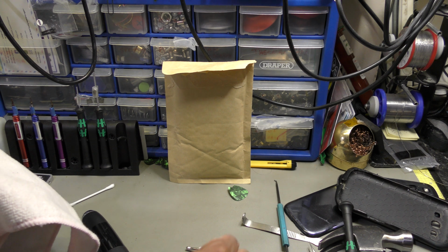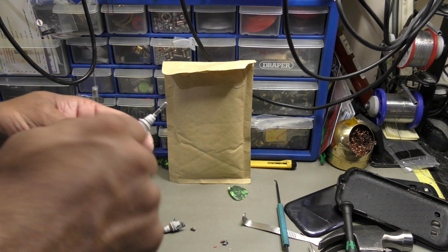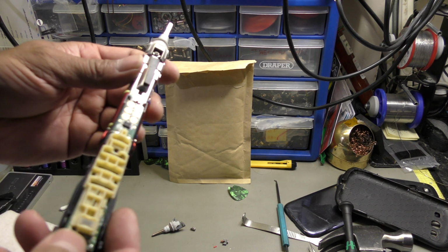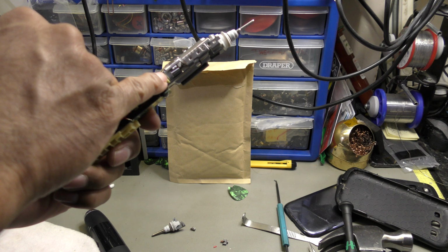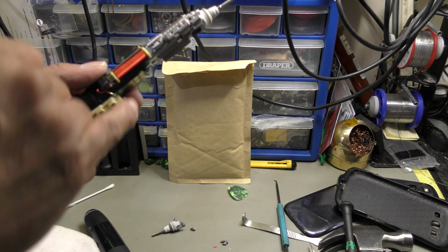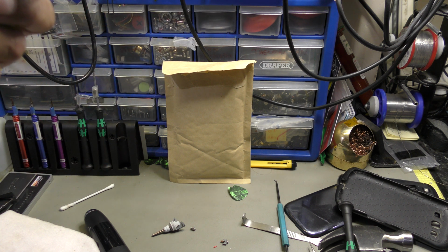Okay, so it's as easy a fix as that. Just give it a firm tightening with a bit of red Loctite, as I said. Inspect for any corrosion or any water. If there is, remove it. A lot of the time, the common problem is that there's no gap between this and the magnet, but with mine there's plenty of space. I would say roughly about 1 millimeter. And yeah, all seems to be working fine.